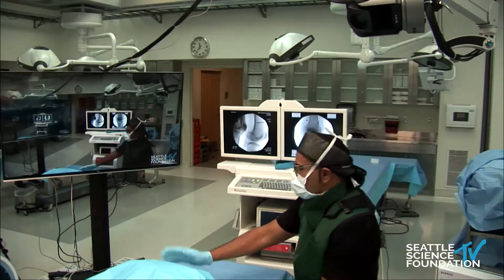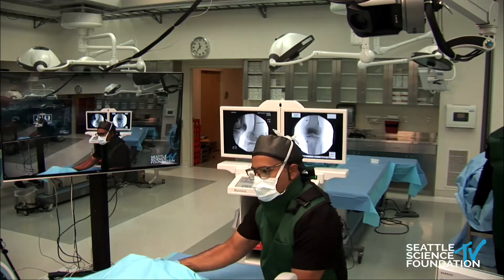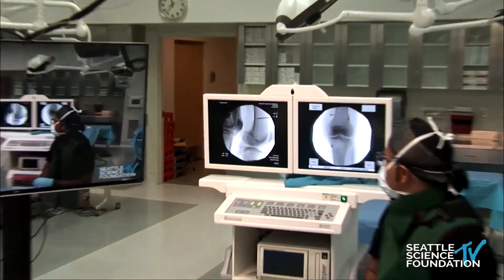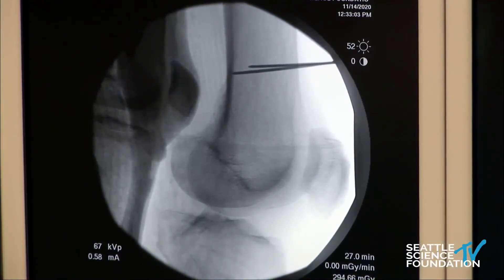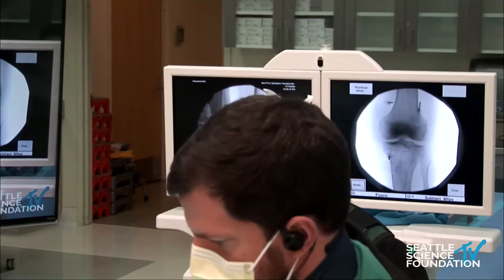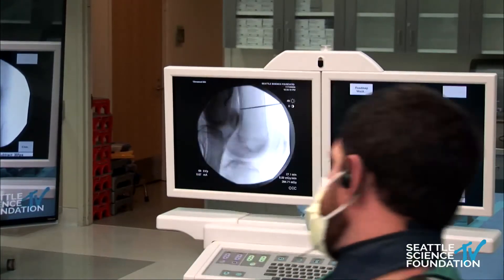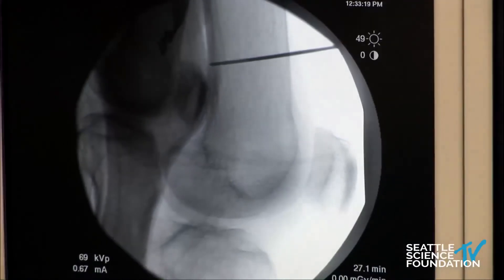We need to internally rotate a little bit more and get the correct oblique. We'll bump up the other way. There we go — we got that all lined up. And then we can do the wag to get those condyles lined up a little bit better so that we have them perfectly overlapping. Seeing the distal end of the femur not perfectly aligned is not as important as seeing the condyles, because that's really going to help us understand how far across the tibial and femoral shaft we are.